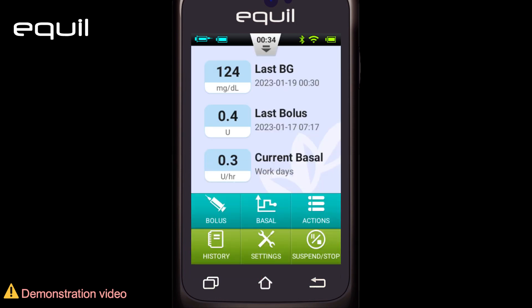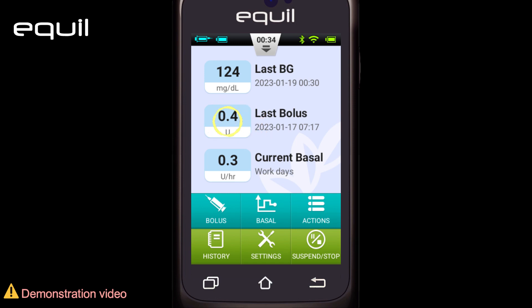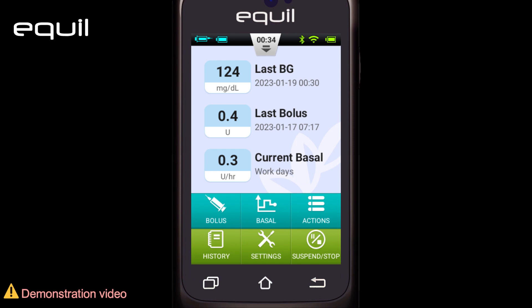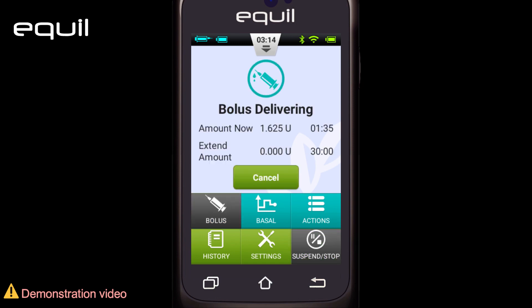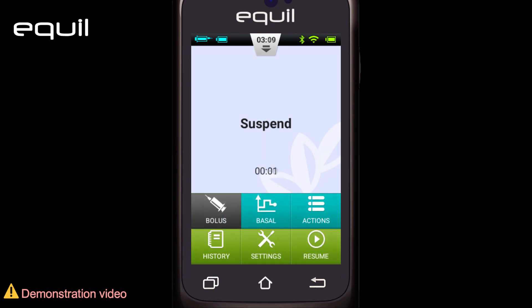In the middle of the home screen, you'll find the three most prominent numbers related to the operation of the pump and the status of its user, such as the most recent blood glucose measurement and the time of the test, the latest bolus when it was administered and its dose, as well as the current basal rate. In certain situations, this area changes to reflect the action taking place at the moment, for example, at the time of bolus delivery, the temporary basal rate status, or the amount of time that insulin delivery has stopped.